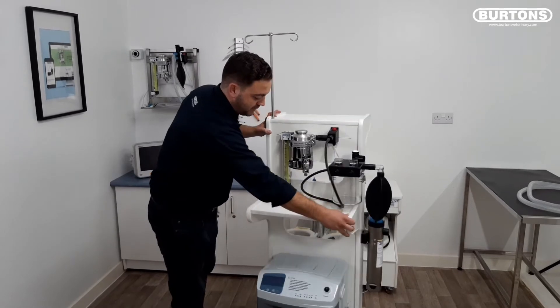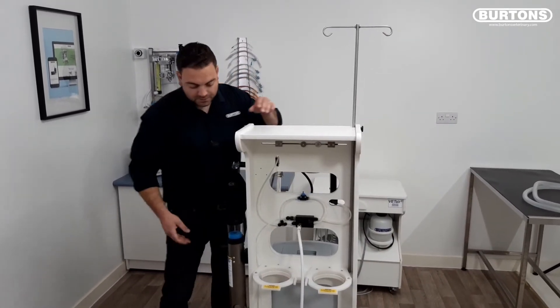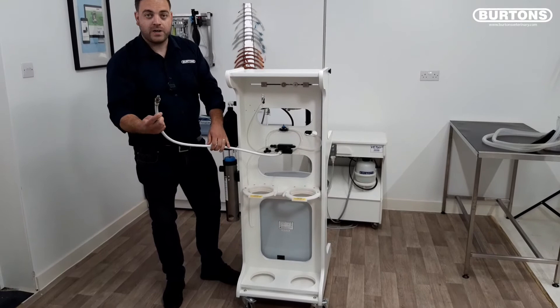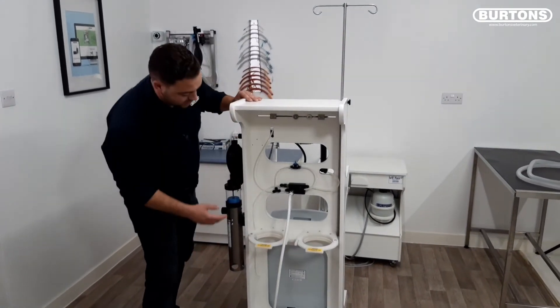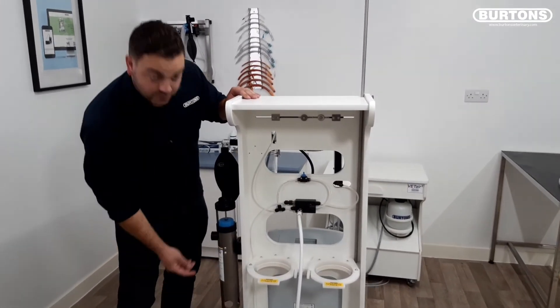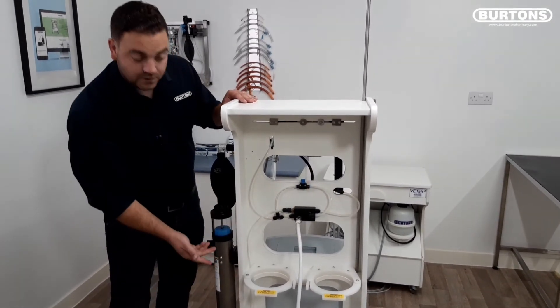Moving around to the back, you can see the machine has cylinder clamps for two F size and does come with a Schrader connection. The machine also has a handy switchover valve so if you are running off the oxygen concentrator and you have a power failure, you can quickly and easily switch over to the backup cylinder.